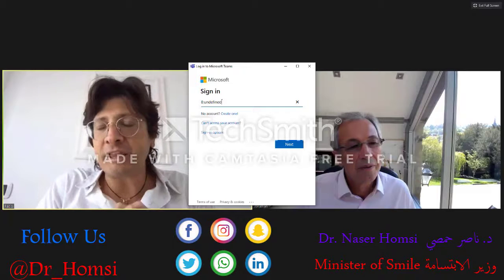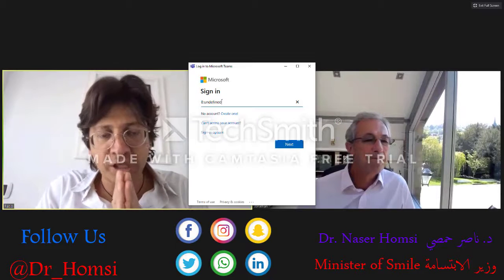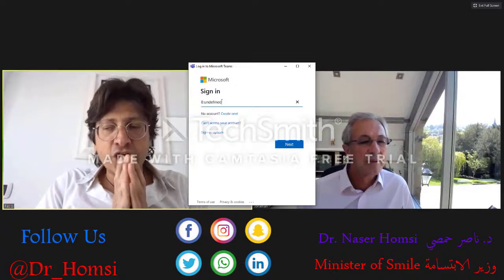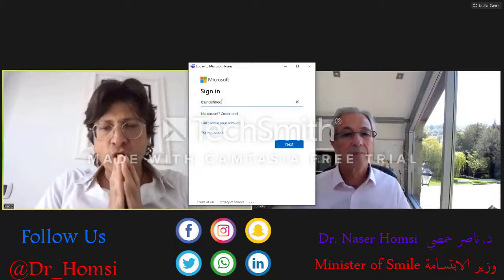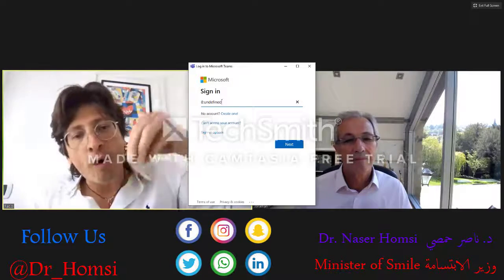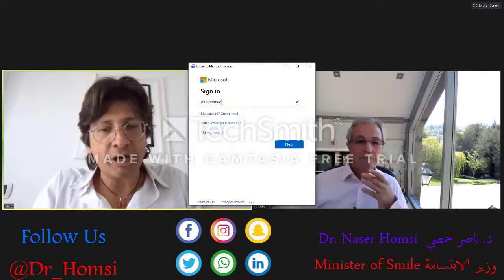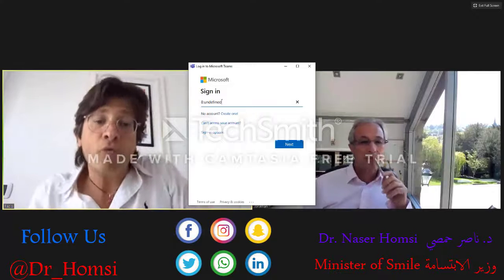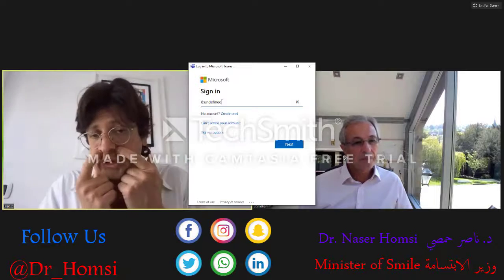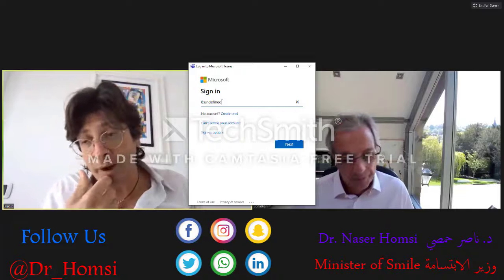I have to tell you that I had a very interesting option from the director of the Maryland University during AAO a couple of years ago, because he showed us how to do this covered by a flap, so undergoing a flap surgical access, and after you can cover. In my hands, the best way to do this is to place two miniscrews, not one. I manage more easily for the upper and especially for the lower.